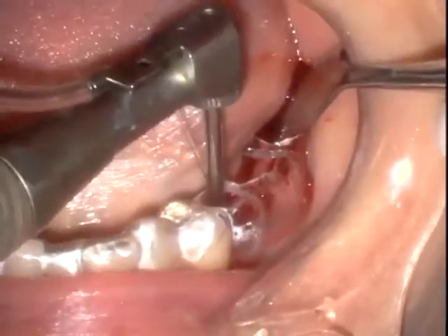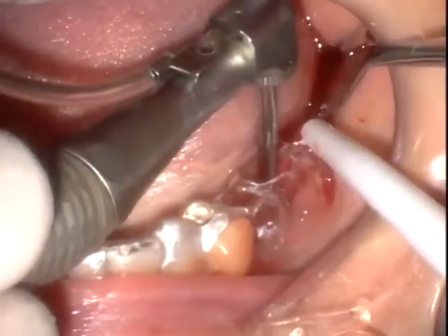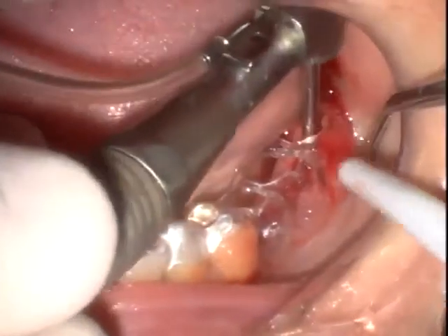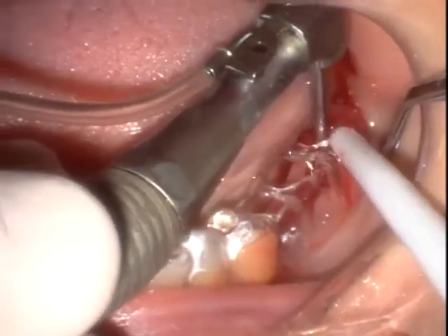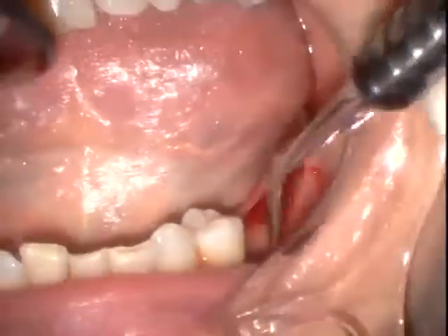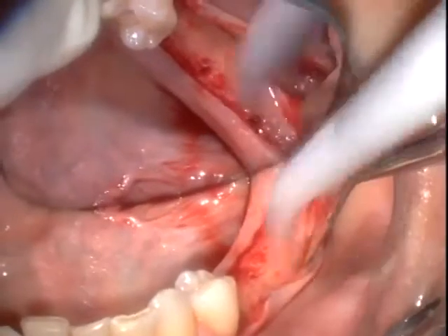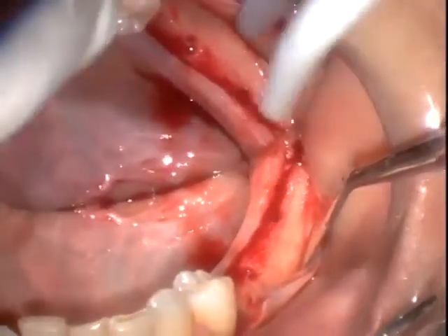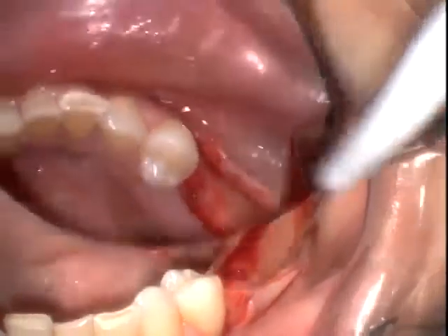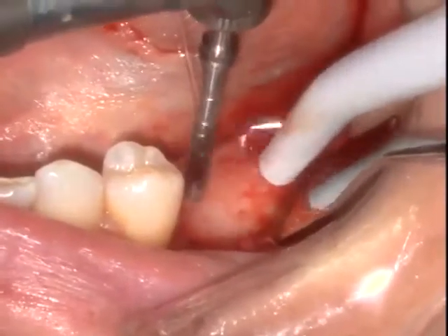A restorative guide is then utilized to initiate the first round drill that enters directly in the position of the future screw access channel or central fossa of the future restorations. This is taken from the cone beam image. This is a duplicate of the surgical guide that was painted with barium sulfate, and you can see those initial drill holes now coordinate with the future position of the screw access and restorations. This is really important to make sure that these initial pilot drills are placed in the right position.